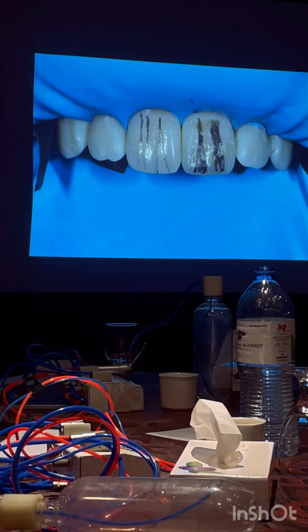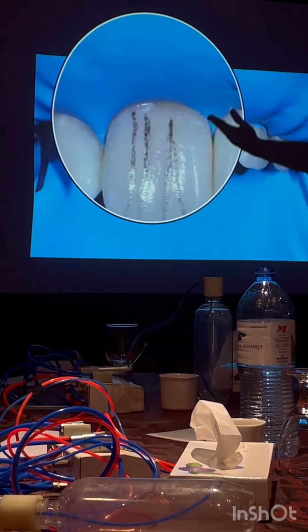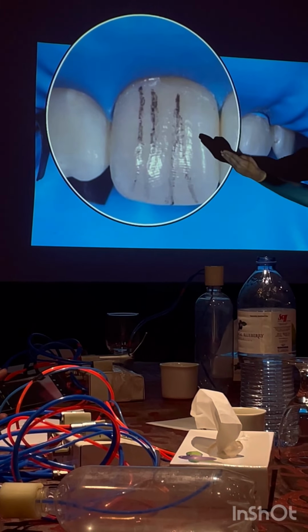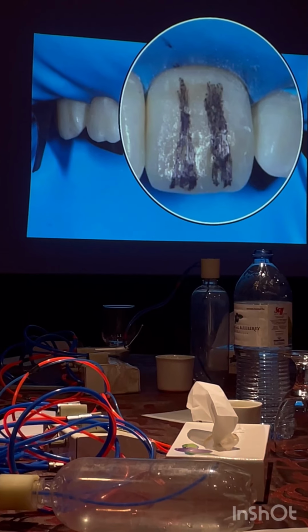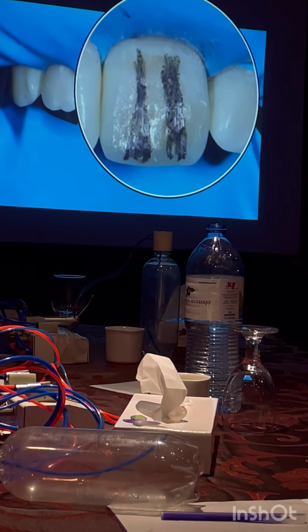So you mark like this with pencil. Can you see? You see here first on the natural tooth. You trace it first. On the adjacent tooth, you trace it. Once you trace it, you know what is there on this side, correct? Once you see, you replicate the same on this side. That's it. This is called tracing. You see what is there on the adjacent tooth, mark that. Once you see, you put that on the other side.